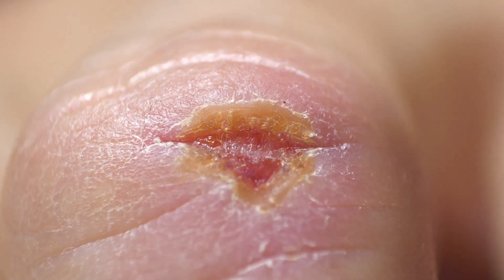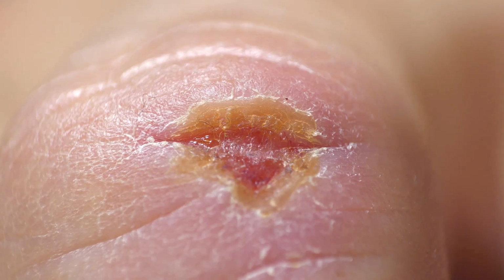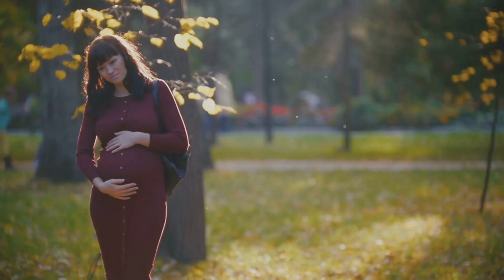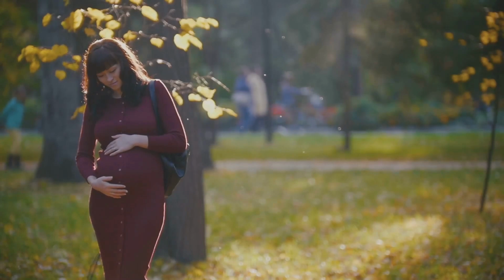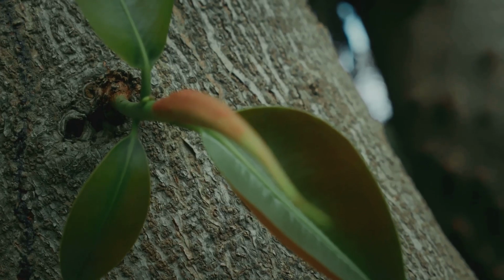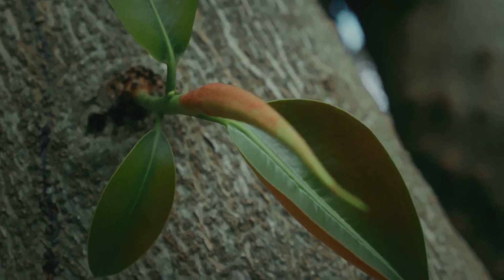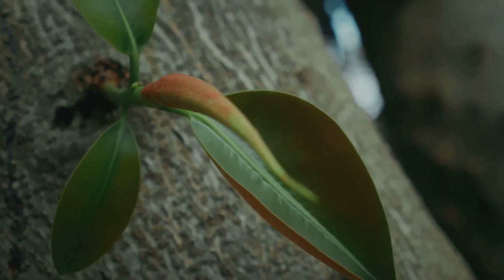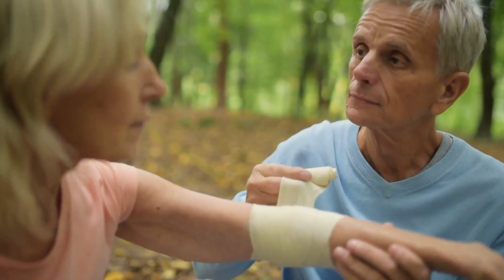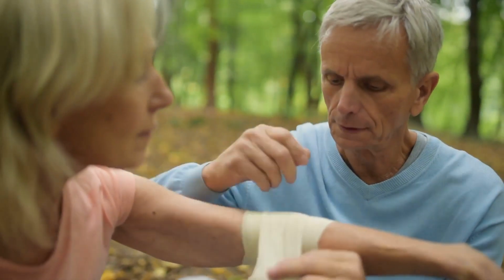These biological dressings, derived from the amniotic membrane, offer a safe and effective way to promote healing in even the most challenging wounds. Amniotic allografts are essentially tissues taken from the amniotic sac, which surrounds and protects the baby during pregnancy. This membrane is a rich source of growth factors, collagen, and other bioactive molecules that play a crucial role in tissue regeneration. When applied to a wound, amniotic allografts act as a biological scaffold, providing structural support and stimulating the body's natural healing mechanisms.